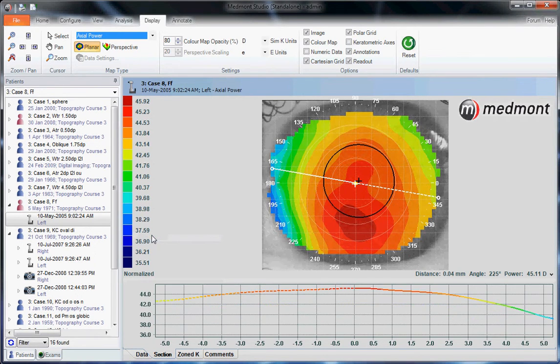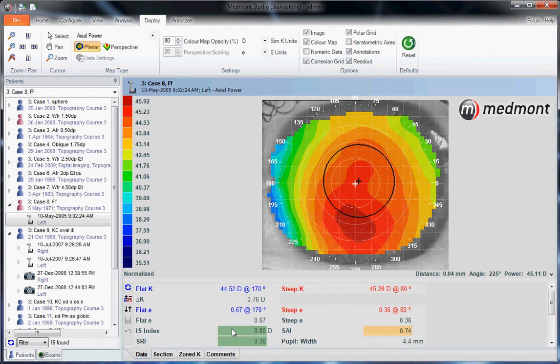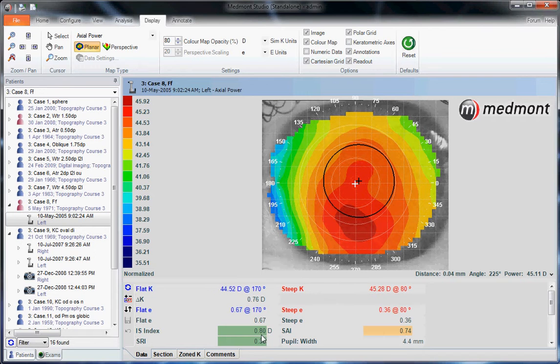Let's go back to a normalized scale and then go down to the data tab at the bottom, where our principal disease detection indices lay. What you see here is the IS, SAI, and SRI value. The IS looks at the inferior hemisphere, averages all the powers, then compares it to the superior hemisphere. If the inferior is much steeper than the superior, you'll have a higher IS value. The vast majority of keratoconus presents in the inferior hemisphere, so we'd expect a positive IS value. In this case, the patient has a 0.8 diopter steeper inferior cornea than superior — normal being less than 1.5 diopters.